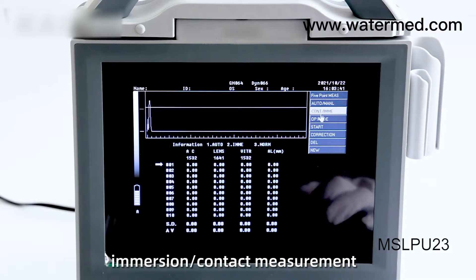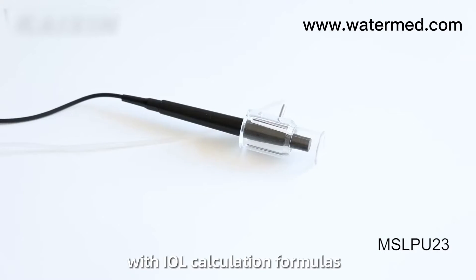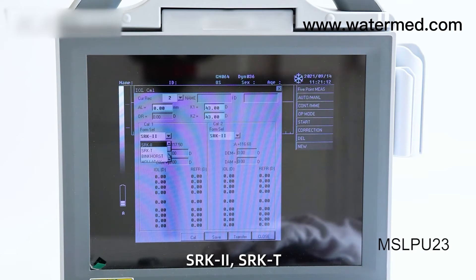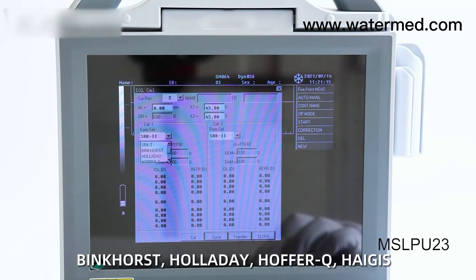A-Scan supports immersion and contact measurement with IOL calculation formulas, including SRK2, SRKT, Binkhorst, Holladay, Hoffer-Q, and Haigis.